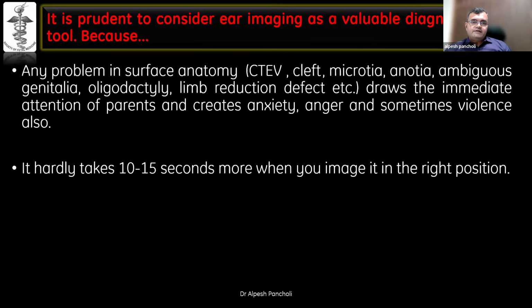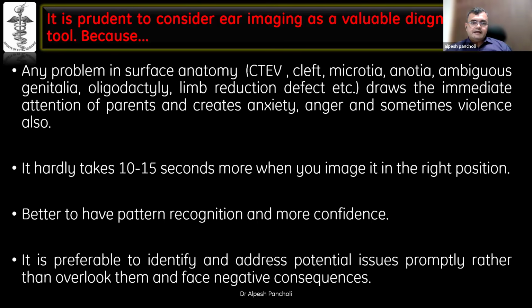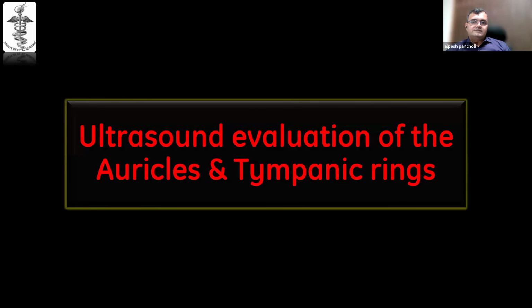It hardly takes 10 to 15 seconds more when you are imaging in the right position and routinely. So it's always better to have pattern recognition of the ear and gain more confidence. And it is preferable to identify and address potential issues promptly rather than overlook them and face negative consequences. Coming to ultrasound evaluation of the auricle and tympanic rings.